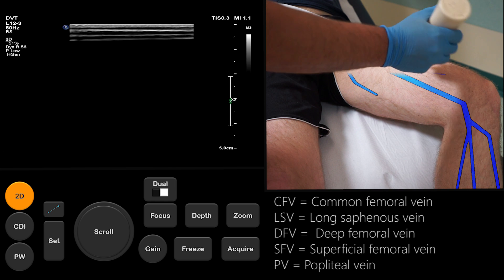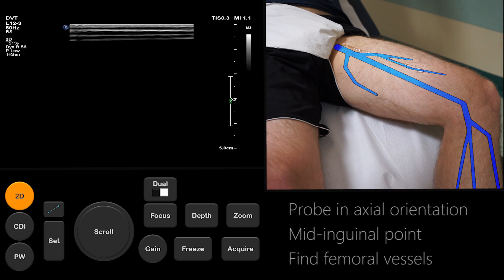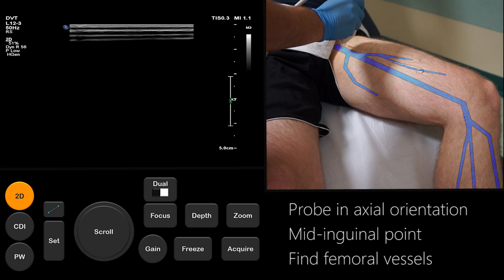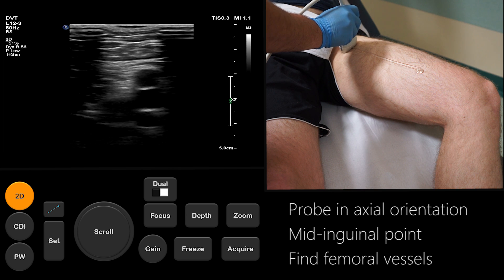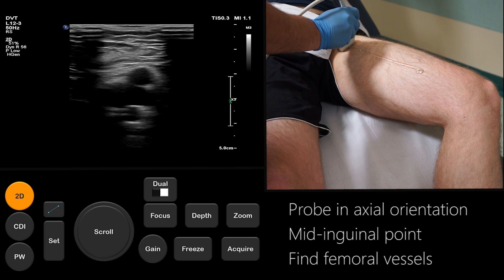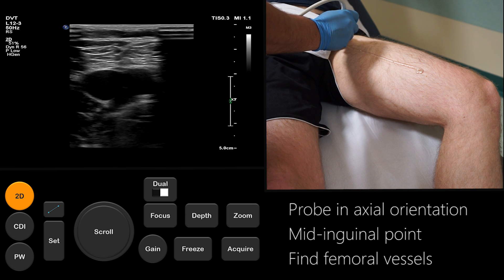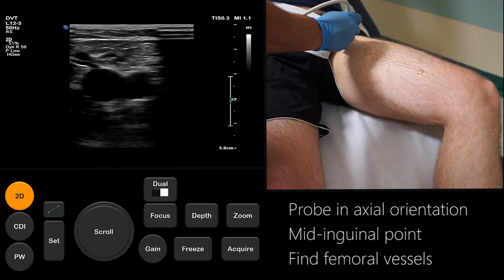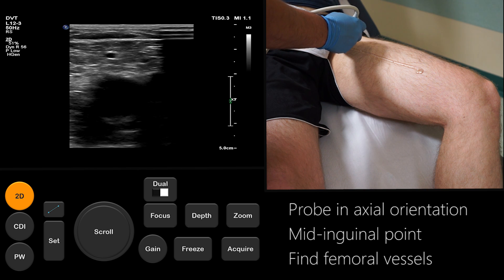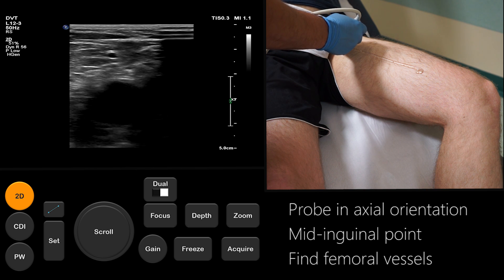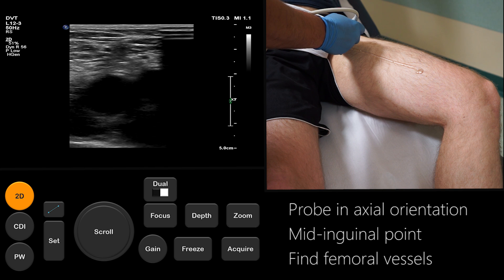We start with the probe in its axial orientation in the groin. Here we see the femoral artery and vein. The femoral artery is pulsatile and lies lateral to the femoral vein. Differentiating between artery and vein is essential. Align the probe so that the superficial femoral artery and vein appear in the center of the image.